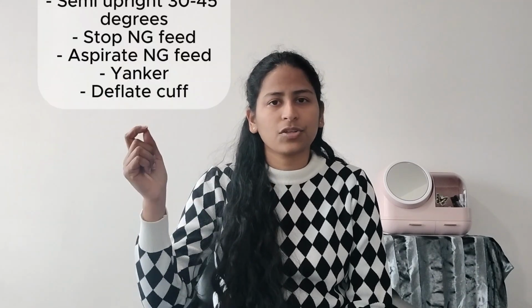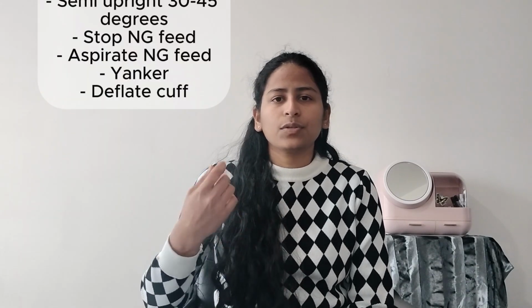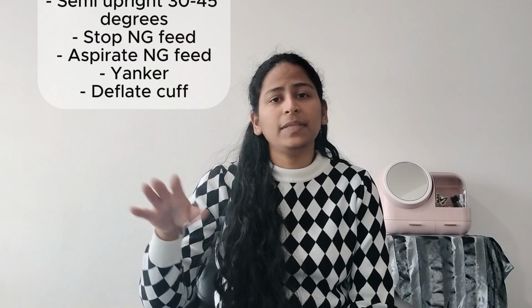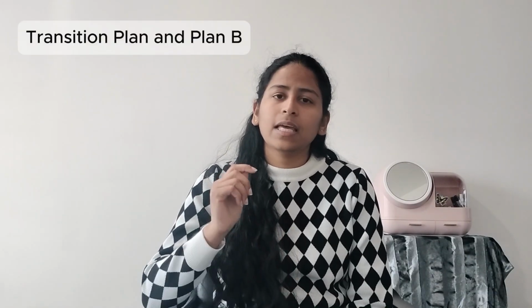Step 4 would be to have your Yankauer suction, which is the oral suction, ready, connected to your suction port. Next is to have your 10 ml syringe ready to deflate the cuff. The other bit will be, once you have extubated, you should have a plan in place of where this patient is going to transit. In the sense, once you take the ET tube out, is this patient going to be left to room air, which is very rare, or do we want to put them on a humidified face mask, or do you want them to be on CPAP or NIV?